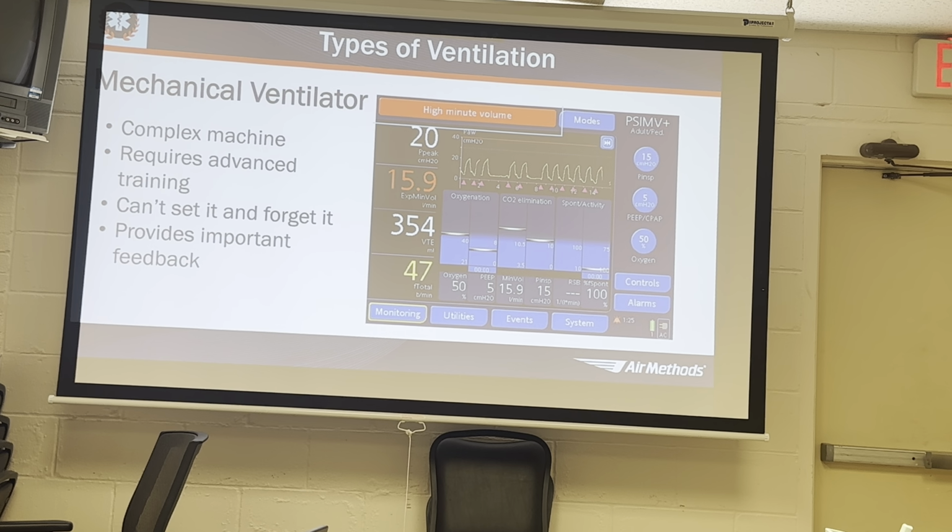So, monitor these patients as soon as we put them on the ventilator, making sure they're adequately sedated, because I wouldn't want to be on the vent without some good propofol or maybe some ketamine. We as nurses a lot of times aren't adjusting the vent, but we're providing information to our providers: hey, now that their paralytics have worn off, they're constantly bucking the vent, it keeps alarming. So get your respiratory therapist involved.